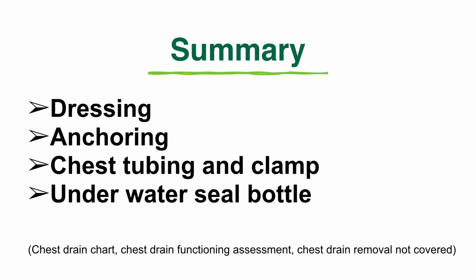In summary, we have gone through some important practical aspects on how to take care of a chest drain. However, we didn't cover chest drain charting, assessment of a functioning chest drain, and chest drain removal. Do consider repeating the video and taking some time to go through it.